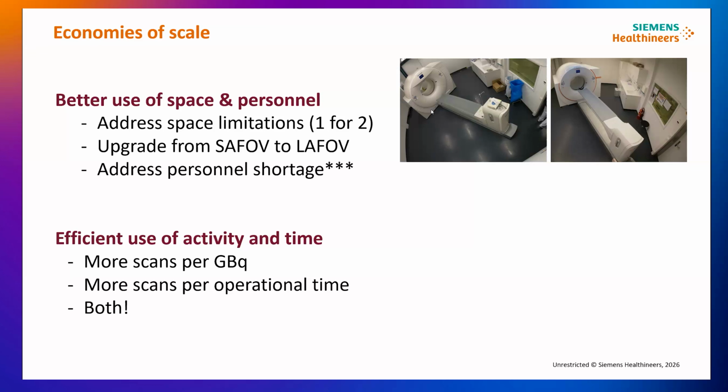It's just a matter of how you utilize the amount of activity that you have, either from your own cyclotron per day or the activity that you buy, and how many scans you can do with this activity, and also how much of the operating time that you have in your practice, and how many patients you can squeeze into this operational time.